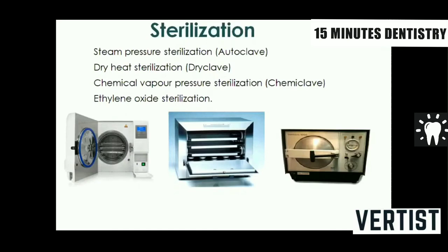You have to follow the sterilization protocol as per the CDC guidelines of 2003, and most probably now there is an amendment of 2018. All routine sterilization methods are there, with the autoclave. And remember, before placing instruments in the autoclave, you need to clean them properly, then in an ultrasonic cleaner, and then subject them to sterilization.